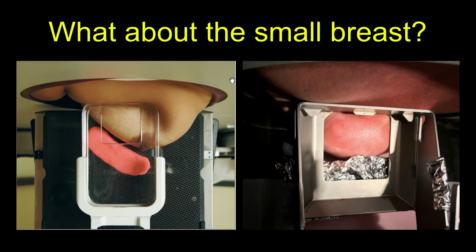How about breasts that are too small to cover the entire opening of the biopsy window? The airspace that's not covered will cause degradation of images. And the way to overcome this is to use Play-Doh, and you can contour that to the shape of the breast and tape it on the image receptor. Or you can just take aluminum foil wrapped around the compression paddle to shield that airspace.